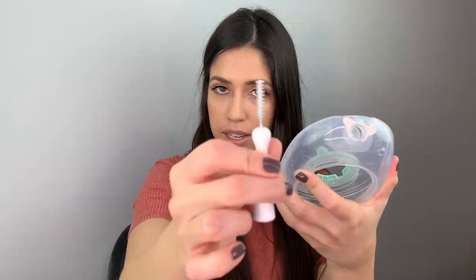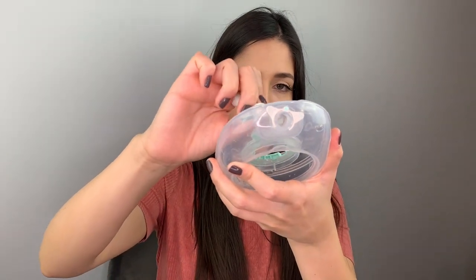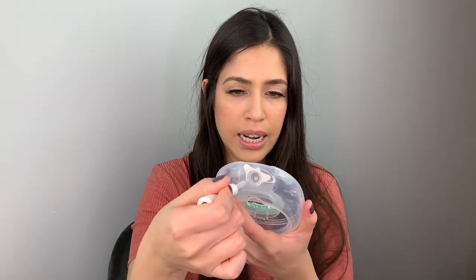I'll just pretend this is a q-tip since I don't have one right now. What you'll do is just clean around with the q-tip. Willow did mention not to use the brushes when cleaning around that part, which is why I use a q-tip. Regardless, you'll get some residue, but what you want to avoid is a lot of residue on the containers.